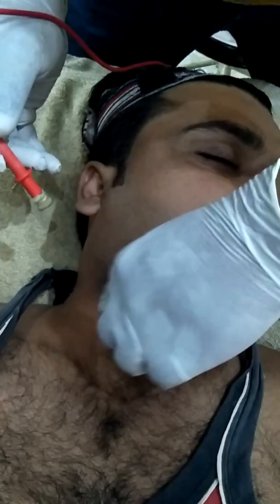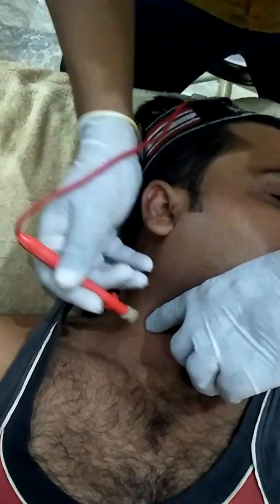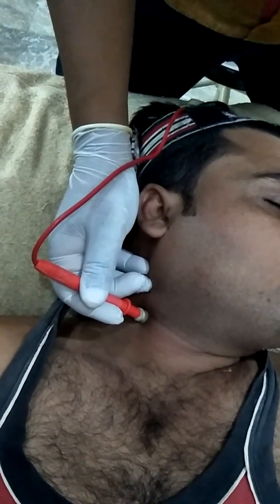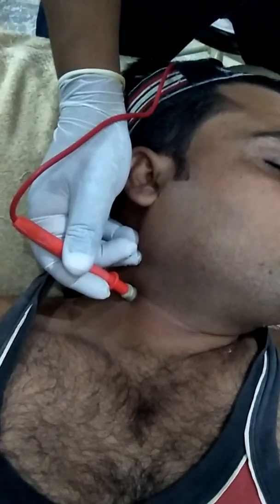Now again, this is the motor point of SCM. Feel the SCM, sternocleidomastoid. This one, place an electrode. You see the contraction.